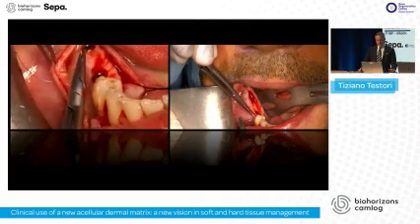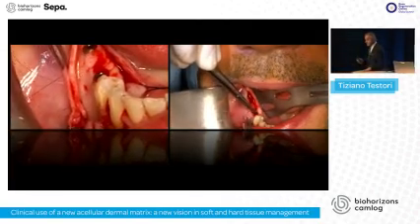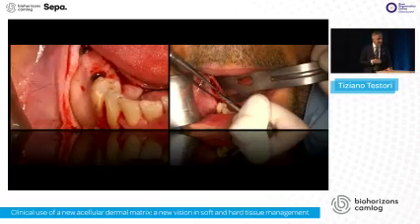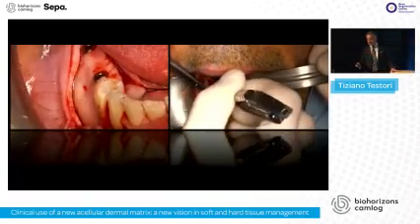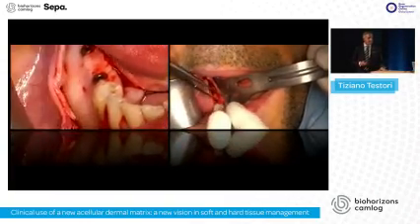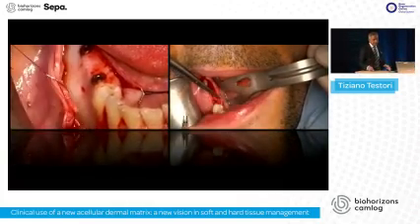Or another video showing you another way to suture, on the buccal side, inside the periosteum, a layer of Novomatrix, and on the lingual side another layer of soft tissue substitute, and then suture the flap.